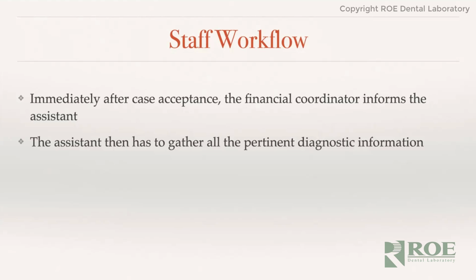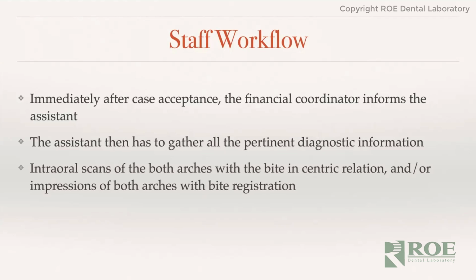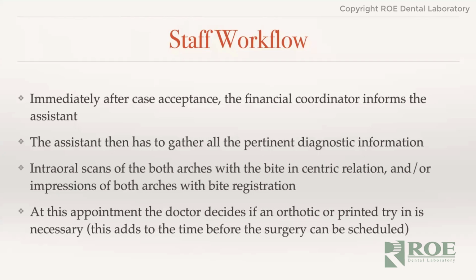This all depends on what we did and said while we were doing our diagnosis with the patient. So the assistant and the financial office also have to understand what steps are going to be involved. The intraoral scans of both arches with the bite and centric relation, and our impression of both arches with the bite registrations, are taken by the assistant at that point in time. I will go in to verify all bite registrations and make sure that they are correct. I think the doctor needs to do that. You cannot rely on your assistants to do this.